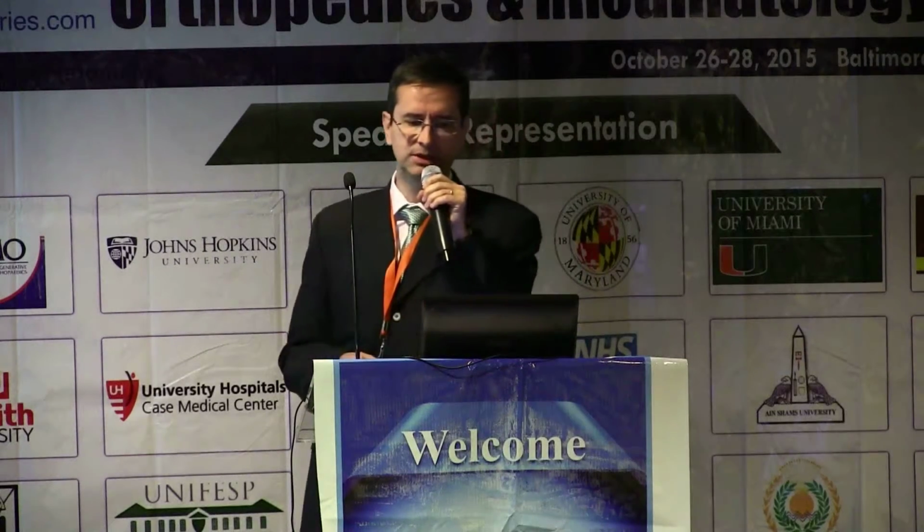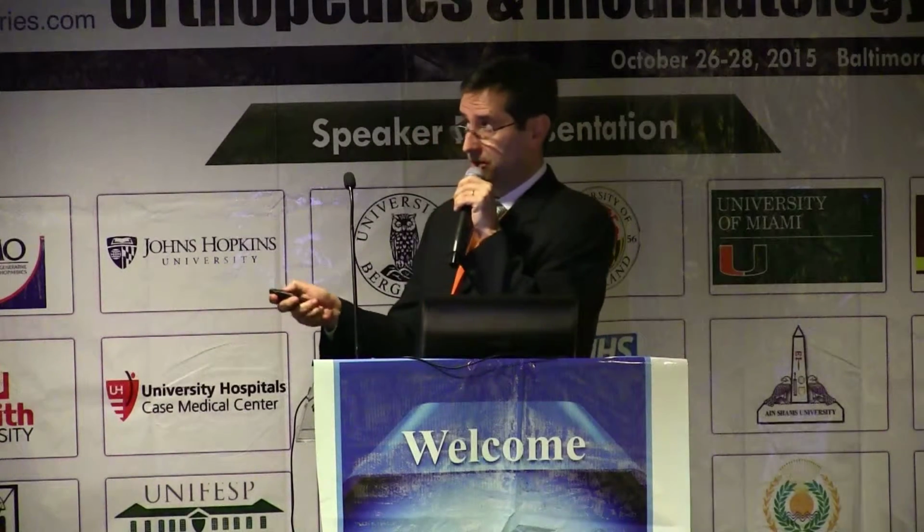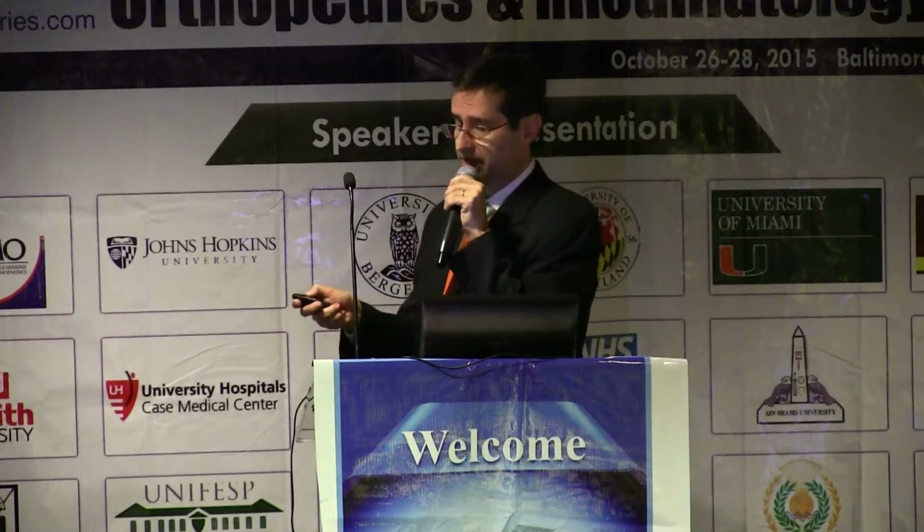The shape of the median nerve is altered due to intraneural edema and the compression determined by the retinaculum. These changes may lead to the nerve looking like an hourglass. This image represents the carpal tunnel on the longitudinal plane.